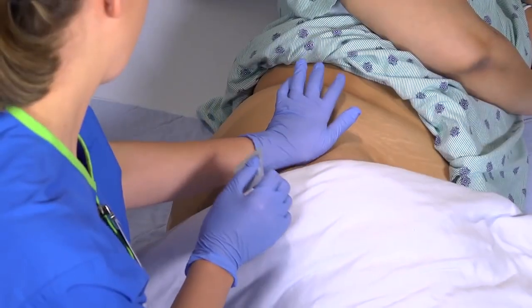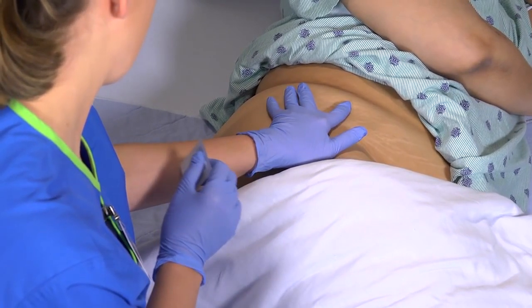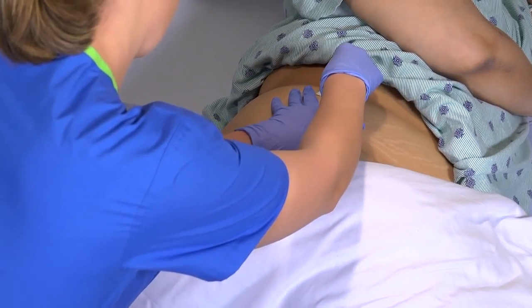For a ventrogluteal injection, place the heel of your hand over the greater trochanter of the patient's hip with the wrist almost perpendicular to the femur. Point the thumb toward the patient's groin. Point the index finger to the anterior superior iliac spine. And extend the middle finger back along the iliac crest toward the buttock. The index finger, the middle finger, and the iliac crest form a V-shaped triangle. The injection site is the center of the triangle. Once you have located the site, it may help to mark it with an unopened alcohol wipe.